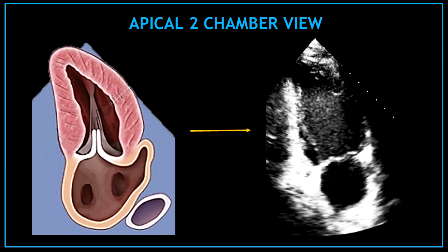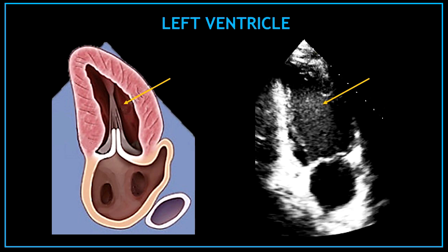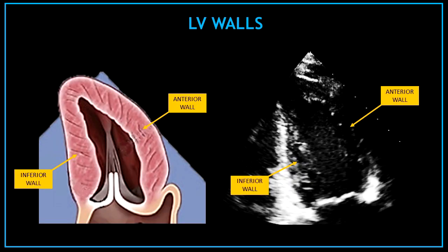Now let's continue with our next view. I'm going to show you all the structures visualized in the apical 2 chamber view. This is the apical 2 chamber view and I can say this is the most simple view from all the apical views. Like the name of the view, only two chambers are visualized in this view. On the top, we have the left ventricle. Two left ventricular walls can be seen in this view: on the left hand side we have the inferior wall and on the right hand side we have the anterior wall.